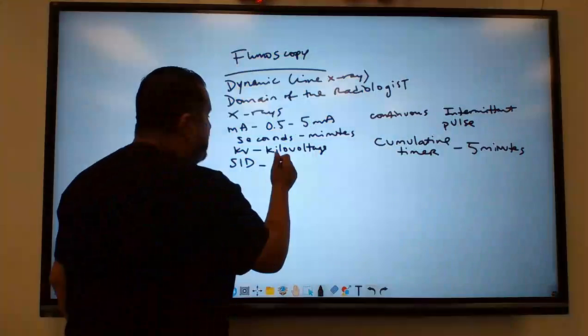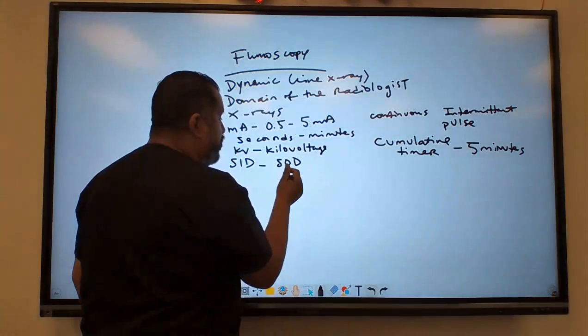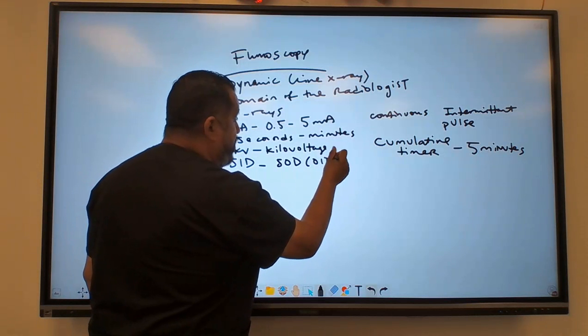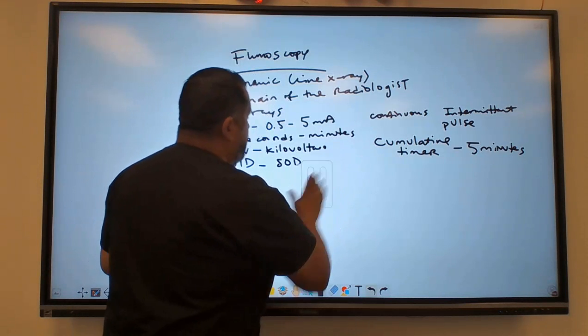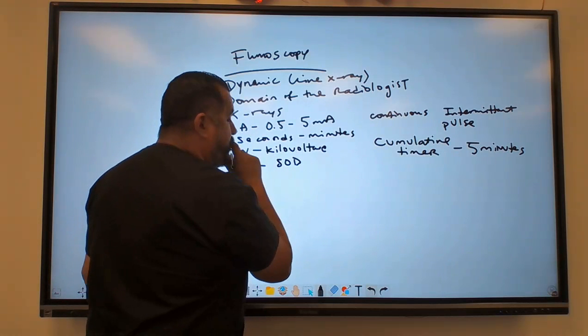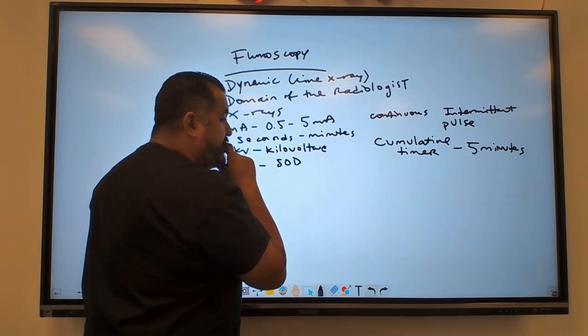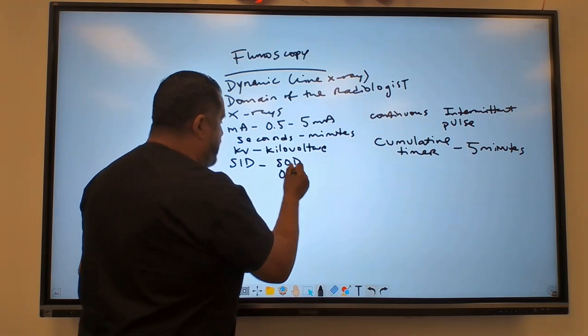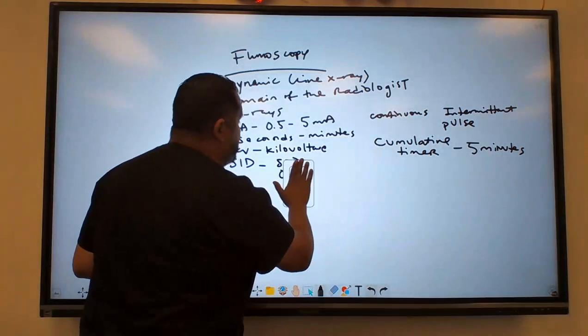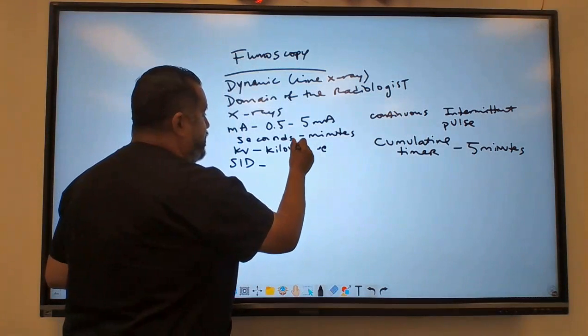And remember, SID is SOD, source to object distance, right? Which in X-ray we called, no, not source to object distance, we called SOD. No? Let's see, SOD and OID is SID. Oh, now I know. I want you guys to know this term. That's what I'm going to say. Kilovoltage.